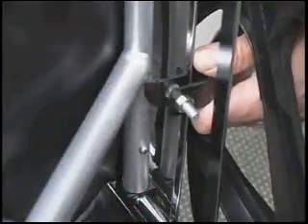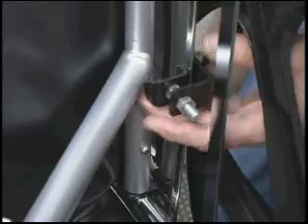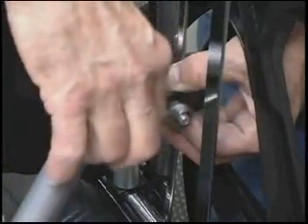In the rare event that it should be necessary to adjust the saddle height on the actuator arm, set the chair on its back, unlock the jam nut, and then turn the saddle clockwise or counterclockwise until the proper height is achieved. Then retighten the jam nut.